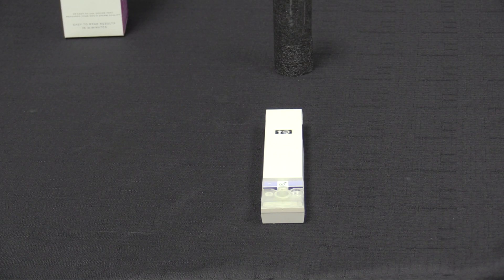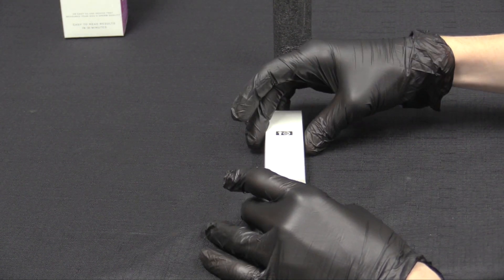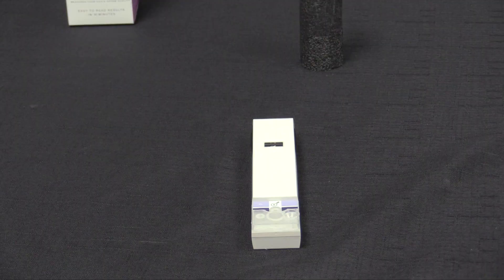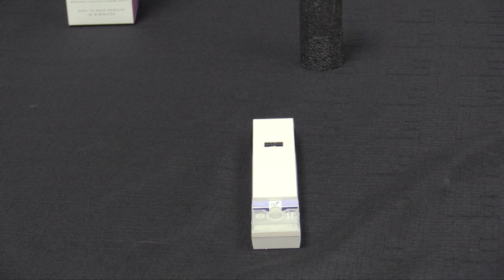Okay so after 30 minutes the next step is to take the slider, secure the test cartridge and bring it all the way back until you hear a click. You can now look at the test window here and interpret the test color result.